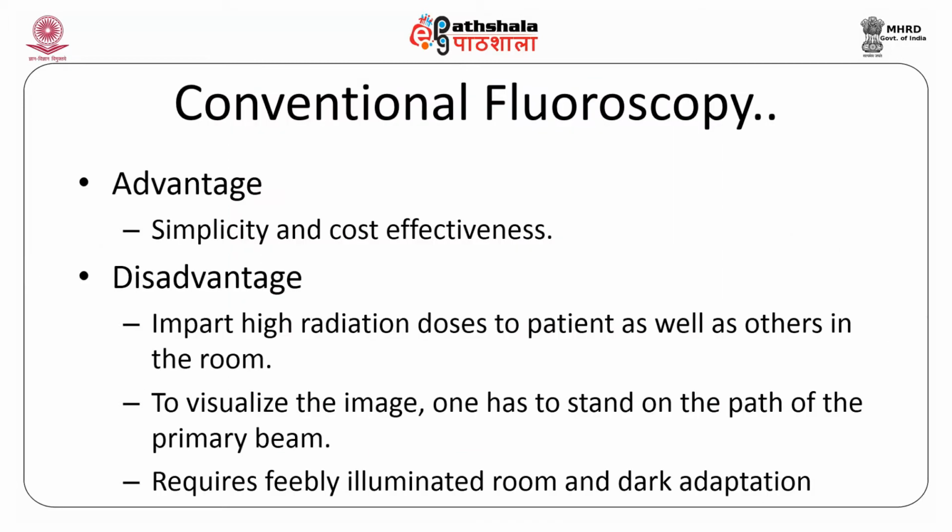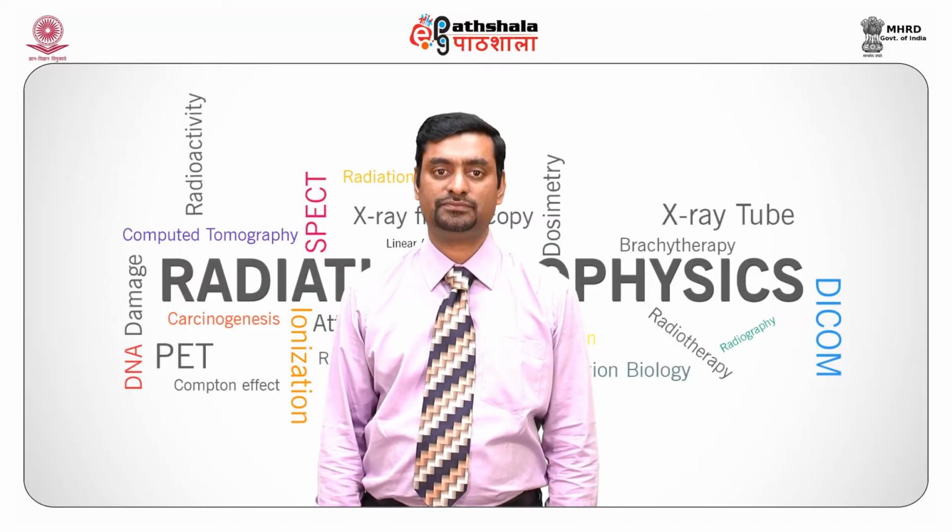So what is the advantage of this conventional fluoroscopy? It is its simplicity and cost effectiveness. The disadvantage is it can impart a high radiation dose to the patient as well as others who are in the room. To visualize the image, one has to stand in the path of the primary beam. And the problem is it requires a feebly illuminated room and requires dark adaptation.